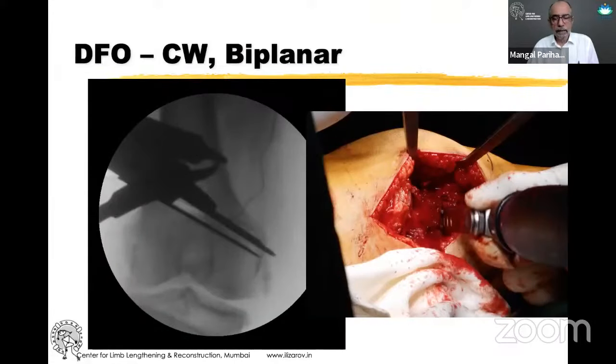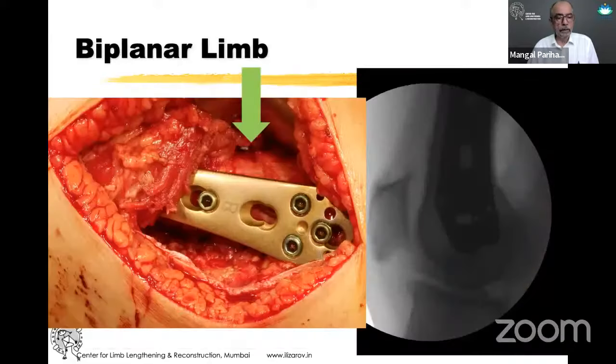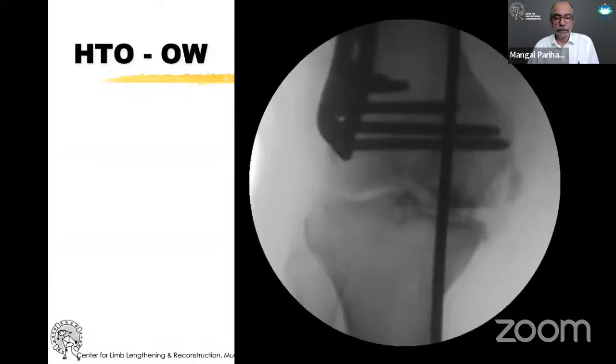This is the standard technique for doing the DFO: a closing wedge with a biplanar component. You can see that vertical component, which adds a lot of stability. This same technique is also used with an open wedge Tomofix. The biplanar design adds a lot of stability and prevents rotation. This is at the end of correcting the femur.